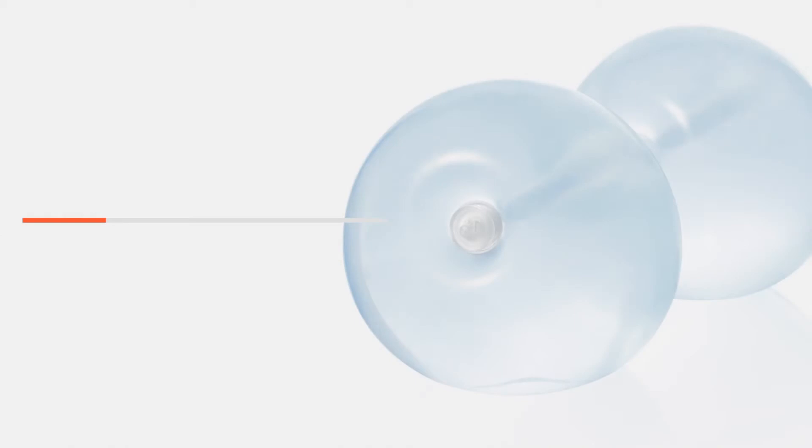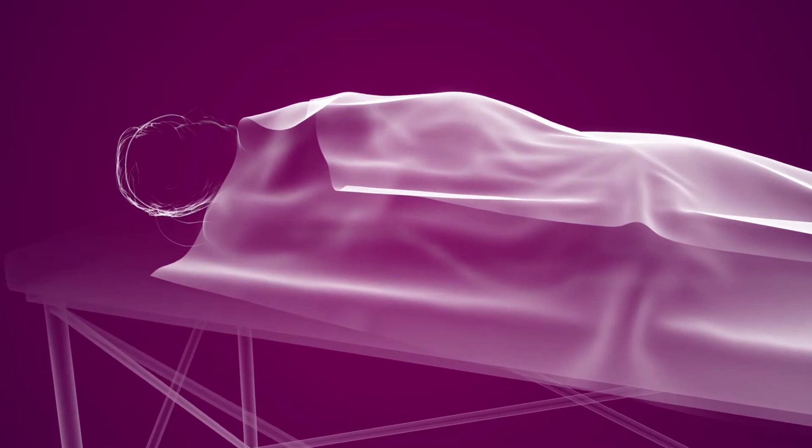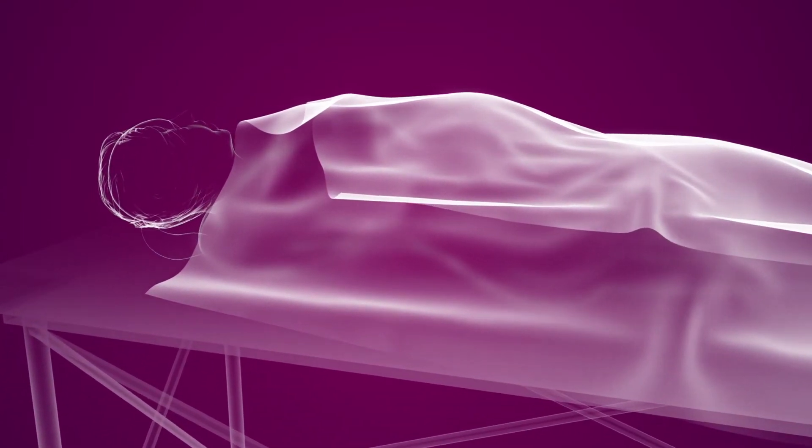Reshape's unique dual balloons are inserted by a highly trained physician in an outpatient medical setting. The procedure lasts about 20 minutes. During the procedure, the patient is comfortably sedated under light anesthesia.